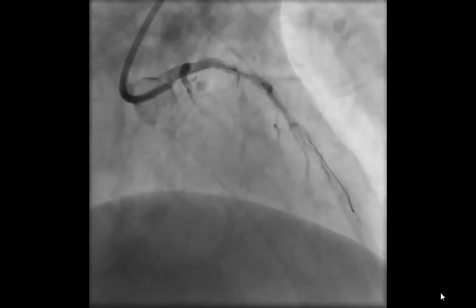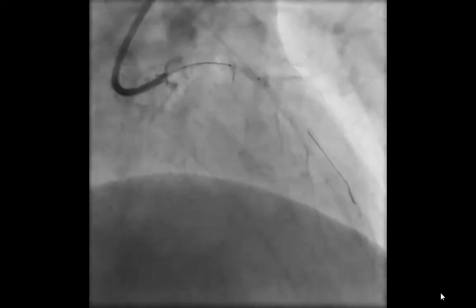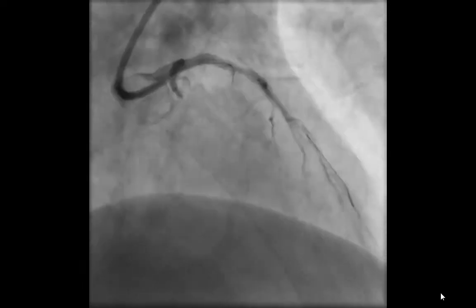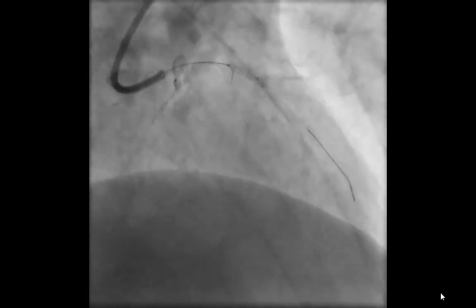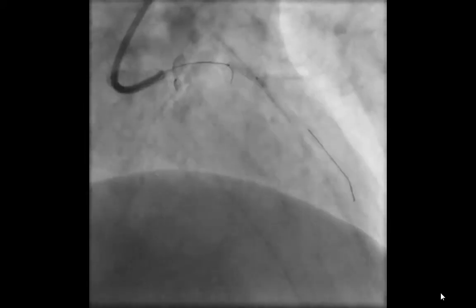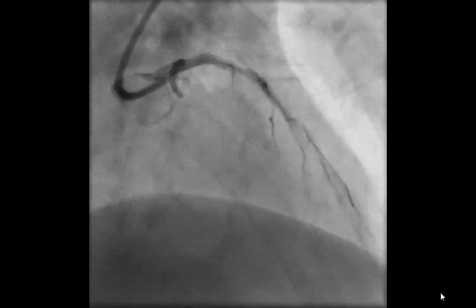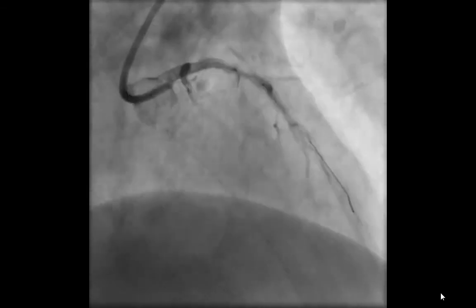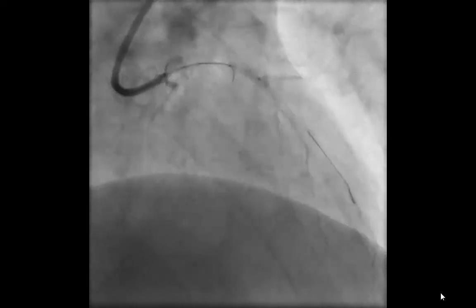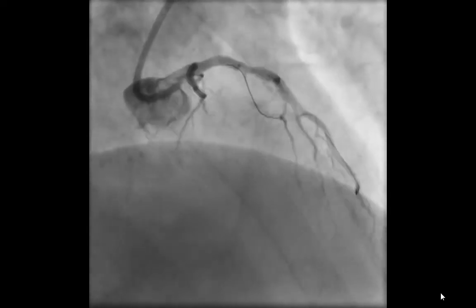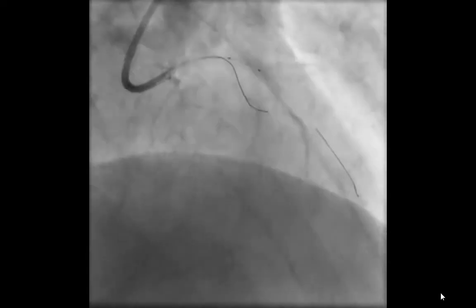At this point, a run-through wire was advanced into the diagonal artery, and a twin-pass catheter was advanced over that wire in the diagonal. The proximal opening of the twin-pass was positioned at the origin of the LAD occlusion. This allowed us to have an anchoring factor with the twin-pass there, and allowed us to use a stiff wire — in this case a Confianza Pro 12 — to actually penetrate the proximal cap of the occlusion of the LAD despite the fact that there was very little purchase in terms of proximal stump.